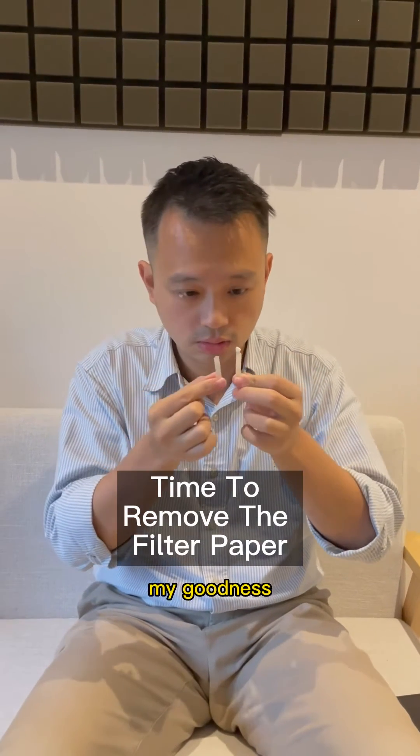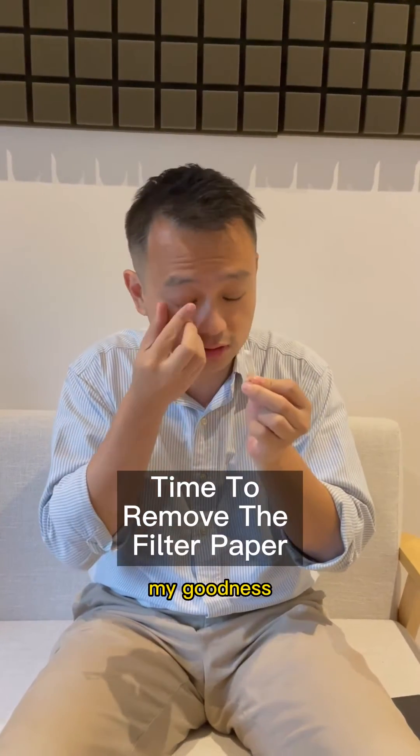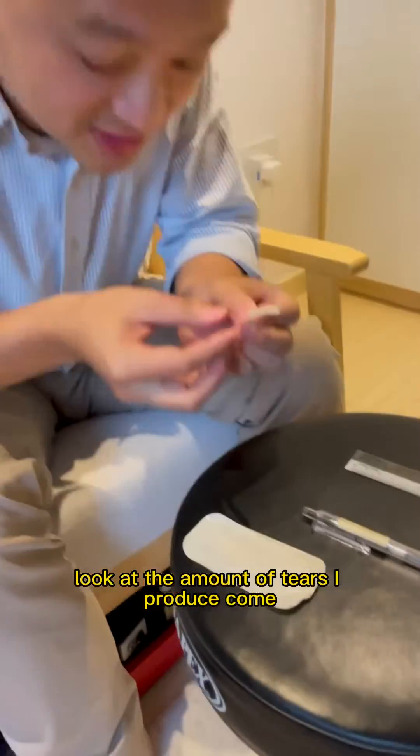Oh my goodness! It's left stuck inside! Look at the amount of tears I produce!